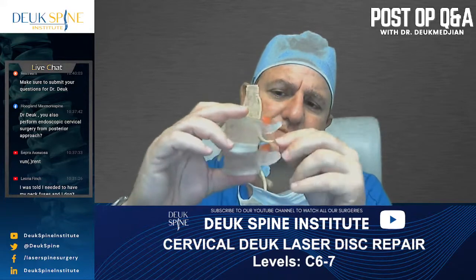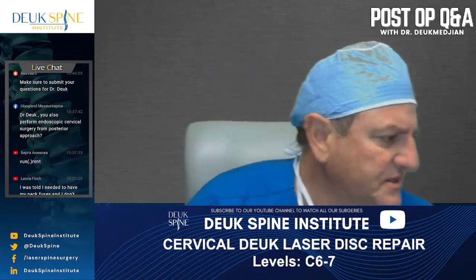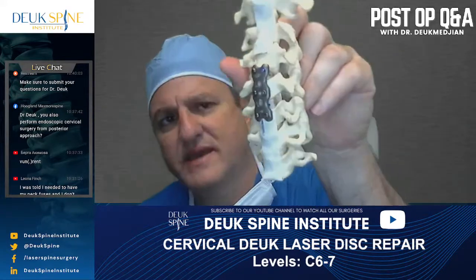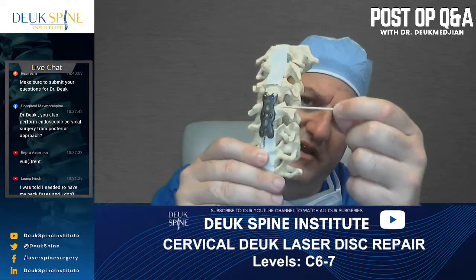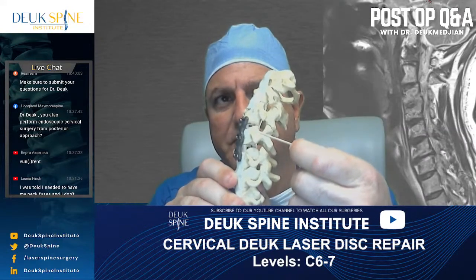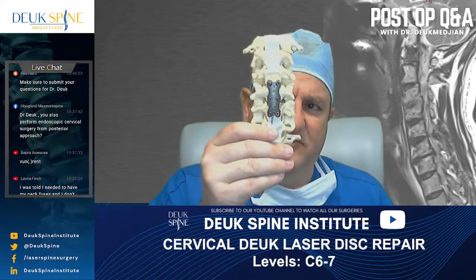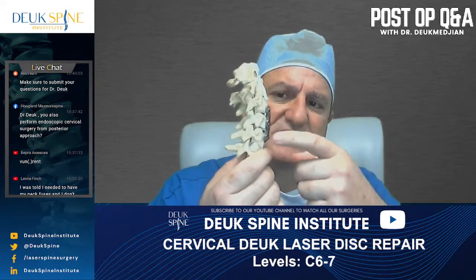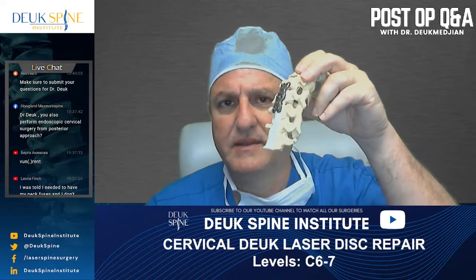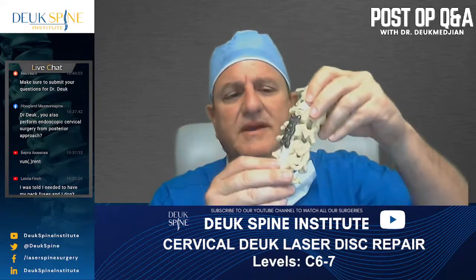Point is, when you fuse bones together with the cage and the metal plate, okay, that's what it looks like. You've got a metal plate and you've got cages. You can kind of see them in there, right? The little cages in there, right there and right there. This is an ACDF, 2-level, okay? 2-level, whether it's C4-5, 5-6, or C5-6, 6-7, doesn't matter. But that's a pretty big plate to be behind your swallowing tube by your voice box the rest of your life. Plus, you lose the movement, all right? So the rest of the spine moves, but that fused segment doesn't move.